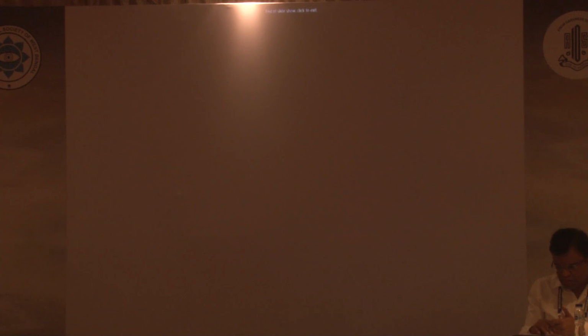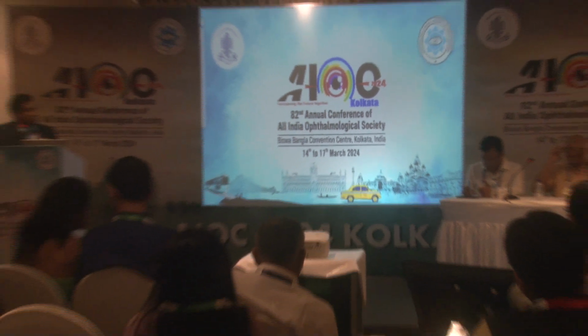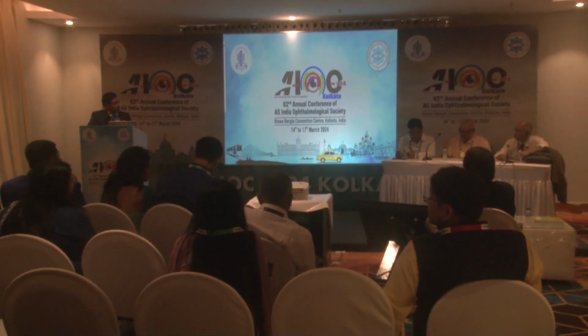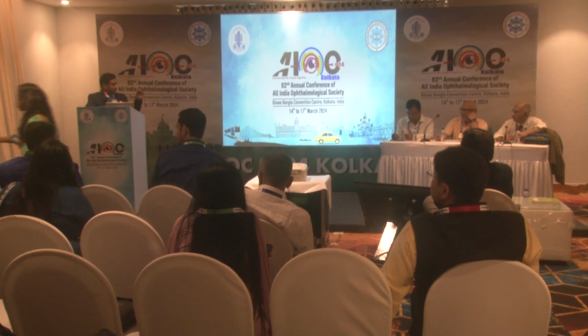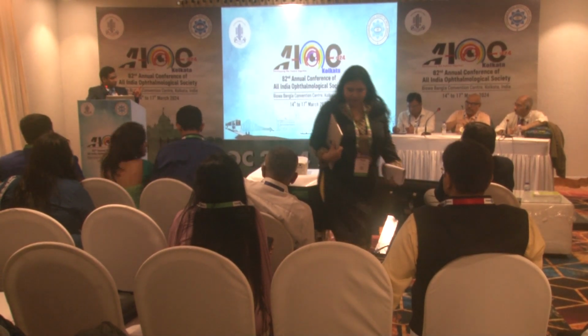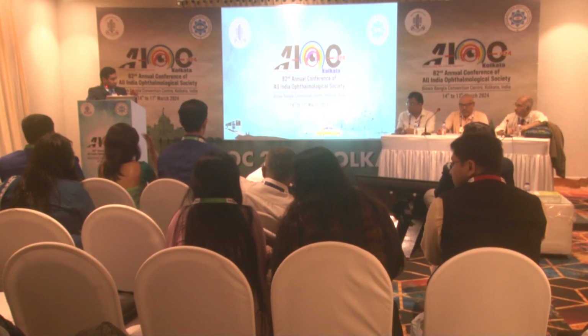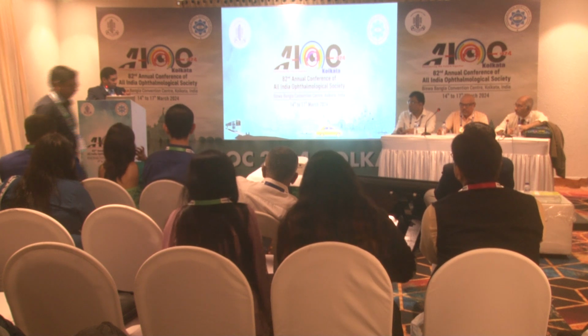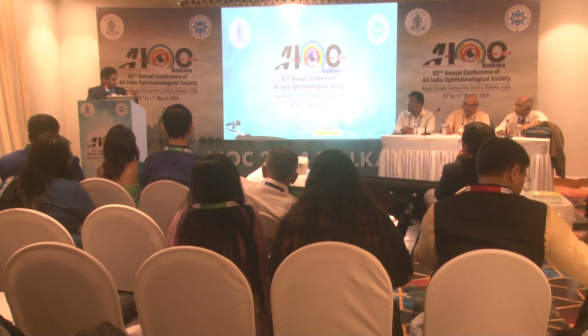Thank you so much. 2 questions. How did you measure 900 microns using the caliper? No, you cannot. You have to leave the bevel part, and exactly you have to measure the 26 gauge needle, and just again you have to measure from the needle hub to that starting of the bevel.